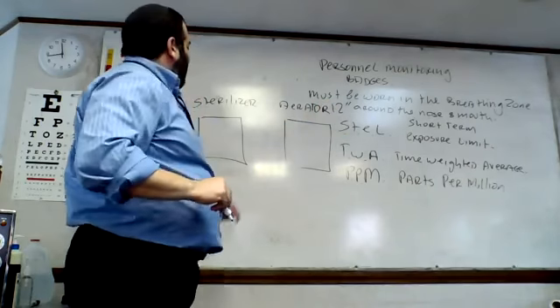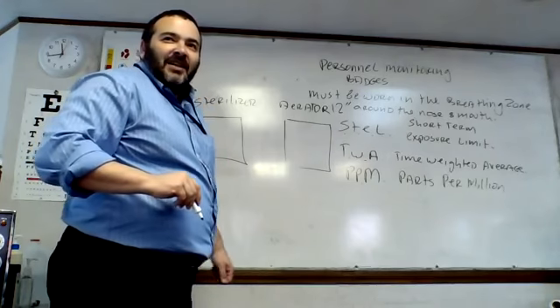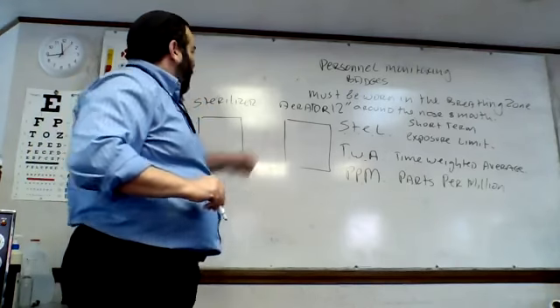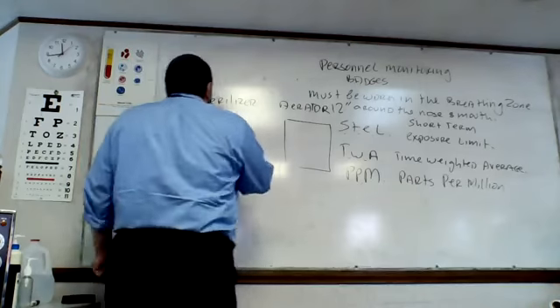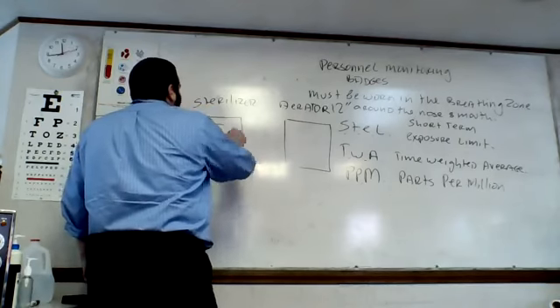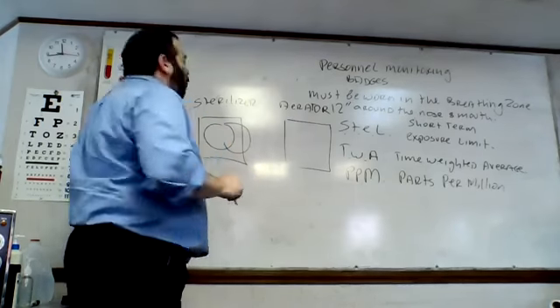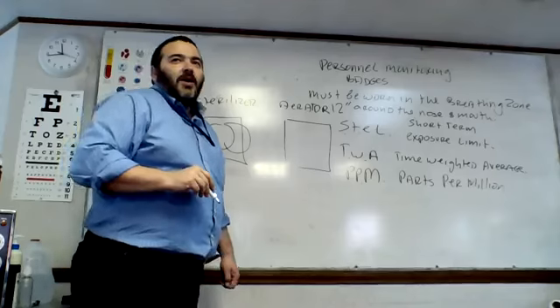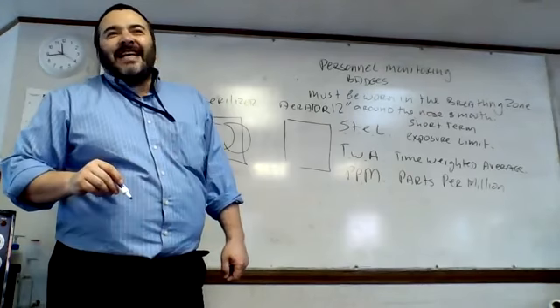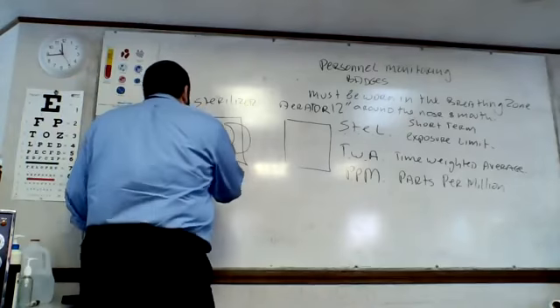Now, with that in mind, you need to transfer from the sterilizer to the aerator. Before you take anything out of your sterilizer to the aerator, you need to open the door 6 inches for 15 minutes.